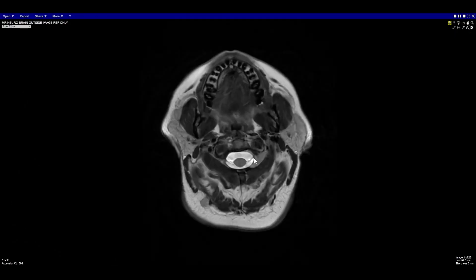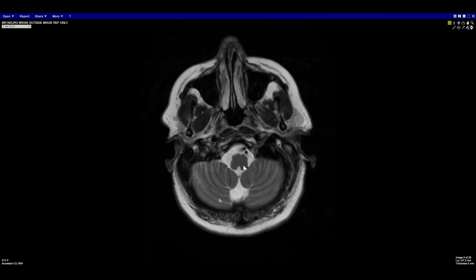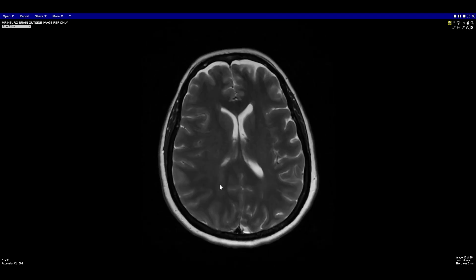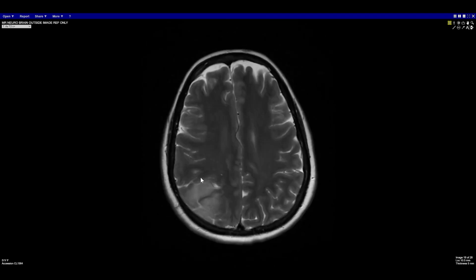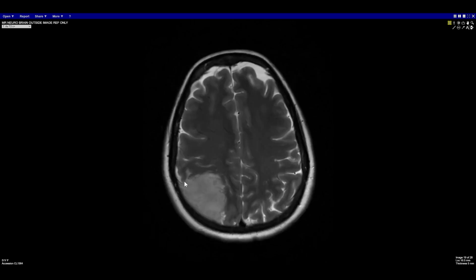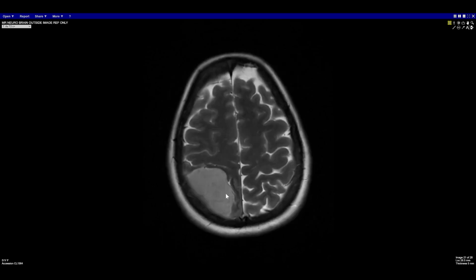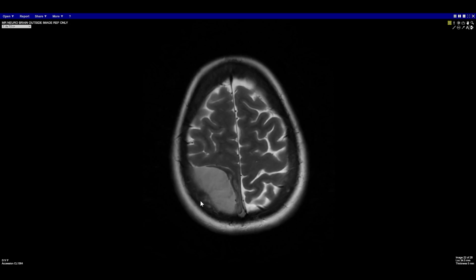On T2, the fluid is really bright. As we get up to the mass, we can see brain parenchyma and a little fissure of CSF around the mass — that's called a CSF cleft. This is a clue that it's not in the brain parenchyma but is an extra-axial mass, coming from outside the brain parenchyma. Up here, we can also see what was probably that area of abnormal bone on CT, with a little radial spoke pattern coming from the portion of the mass along the calvarium.